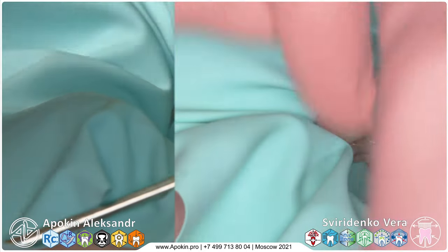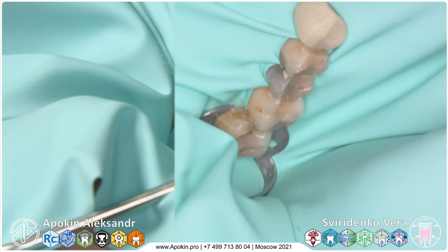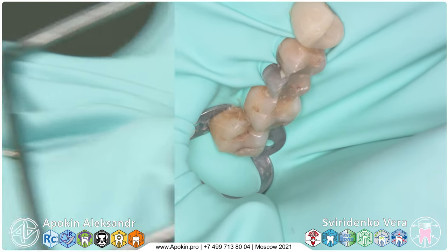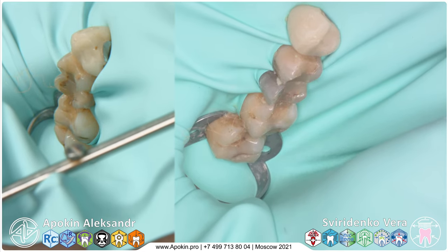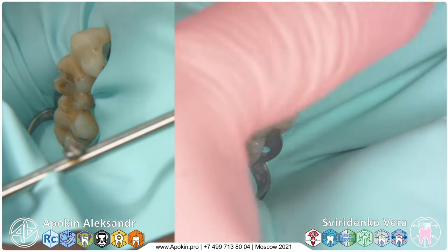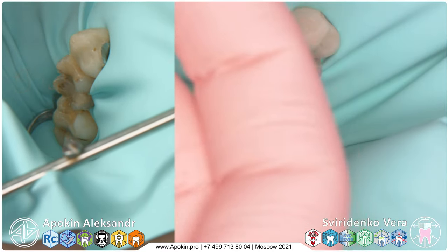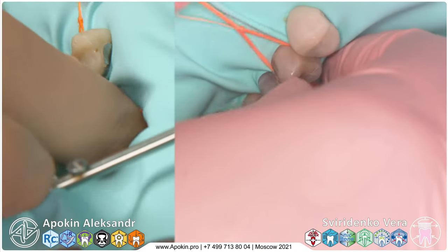Then prepare floss ligatures to wrap around all teeth you treat. I prefer to use the double ligatures, making it this way. I make this loop and then loop it again twice. So we have a very nice and very good fixation for the rubber dam in the cervical area.